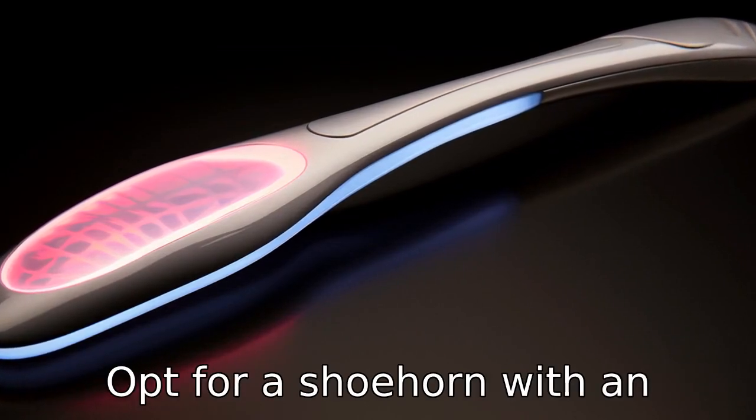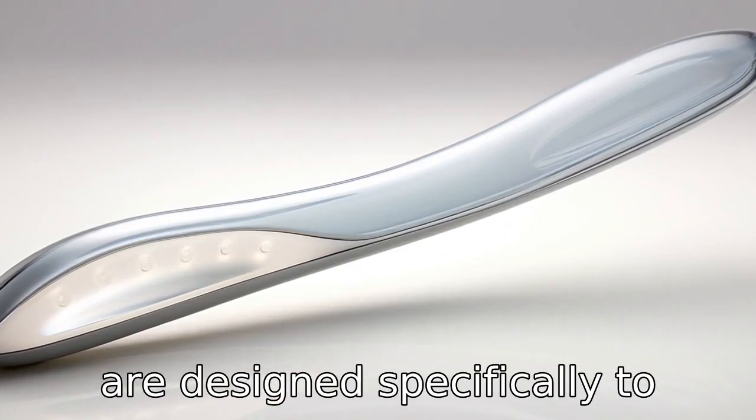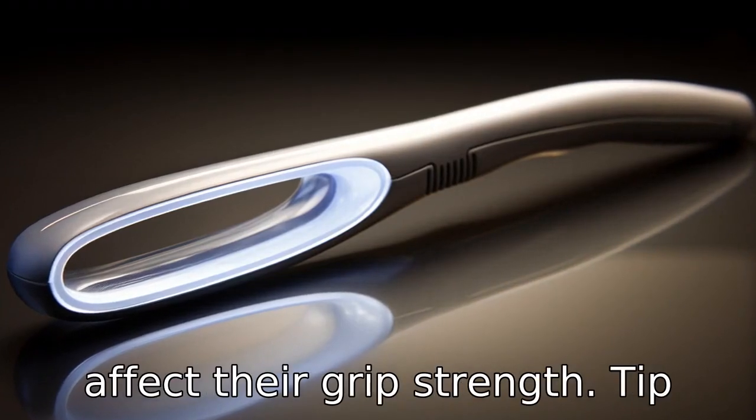Tip 2. Opt for a shoehorn with an ergonomic design. Some shoehorns are designed specifically to comfortably fit in the user's hand, which can be very helpful for seniors who may have arthritis or other issues that affect their grip strength.